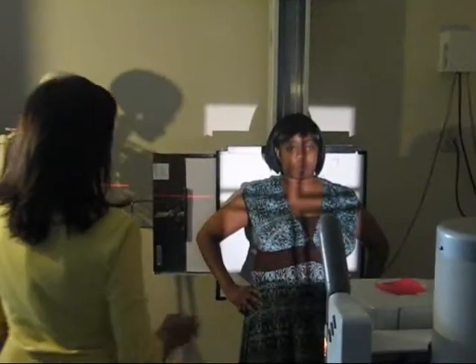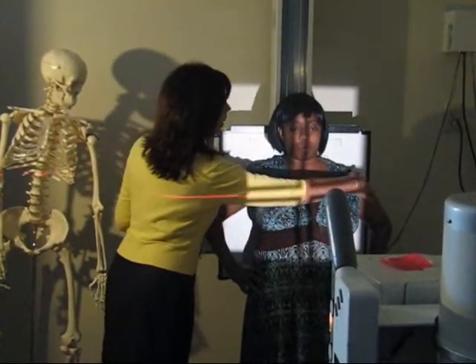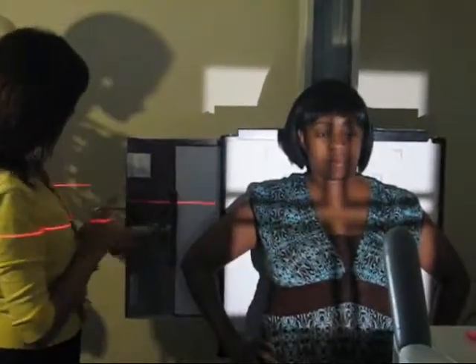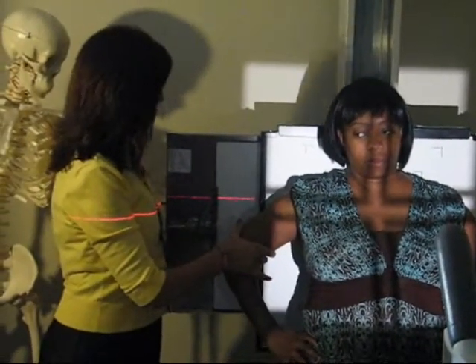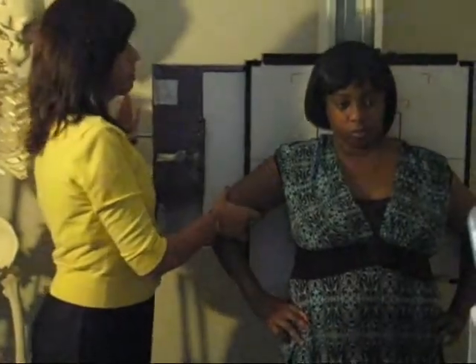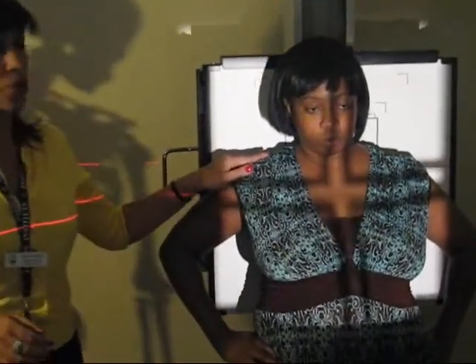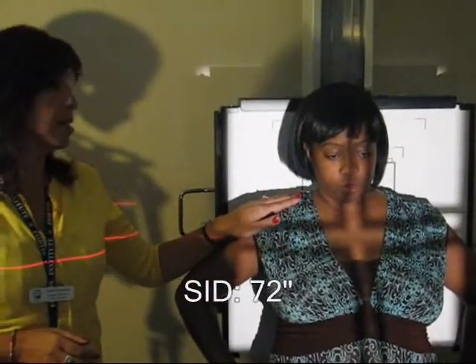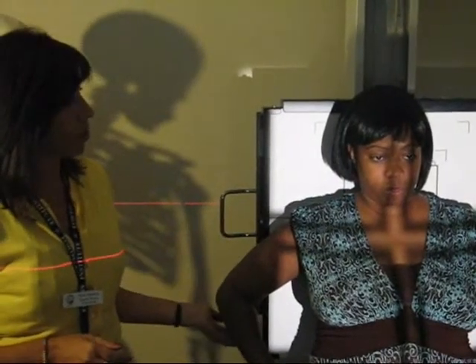Okay, we're going to need to center her. The central ray needs to go right alongside the sternum, so we're going to bring her this way a little bit, about mid-sternum, and of course now we have to adjust the IR so that everything is centered. Okay, make sure the patient is very well centered, and there's your lordotic. You should get a free view of the apices of the lungs without any superimposition from the clavicles.